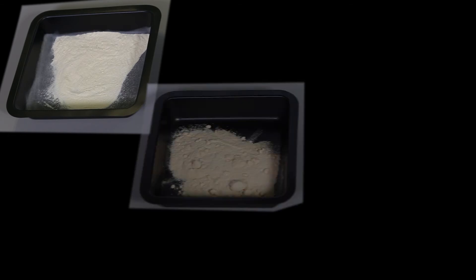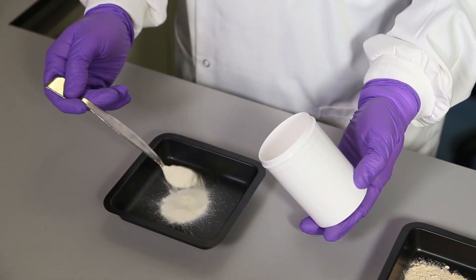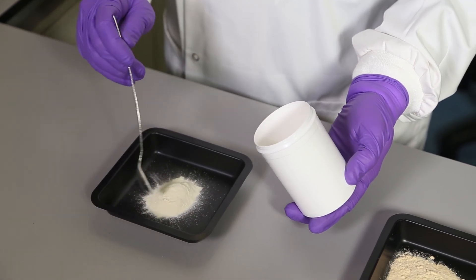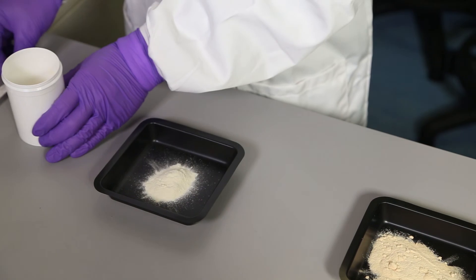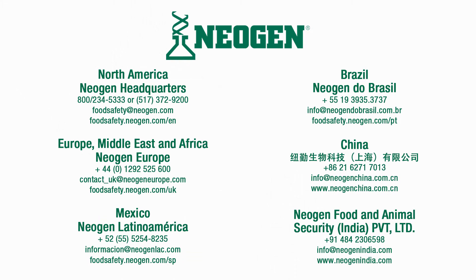Here I have three examples of dehydrated culture media, each one progressively more moisture damaged than the other. It is for this reason that one of the first physical checks we would advise, if you are uncertain about the integrity of your media following storage, is to check that the powder is fine, free flowing and homogenous, as you can see with this last sample.